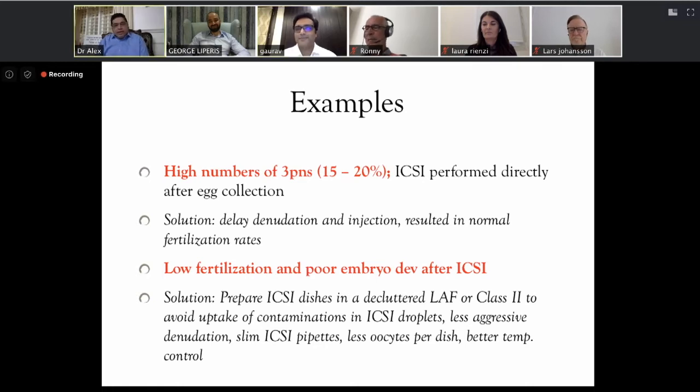Yeah, I agree with the panelists on these things. So we have to stick to the KPI and the total quality management or the data management system. I can just mention an example that I came across in an Indian scenario, because you know that the gases we use for the tri-gas incubators are sometimes a culprit for the outcomes.